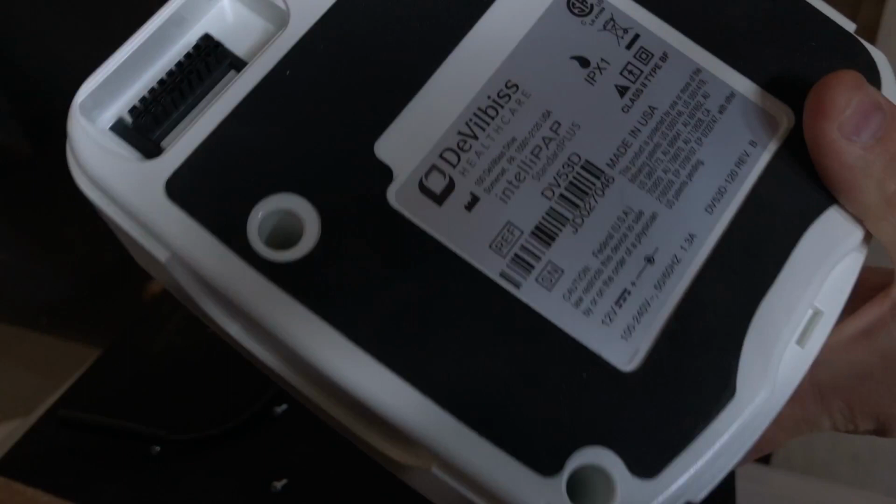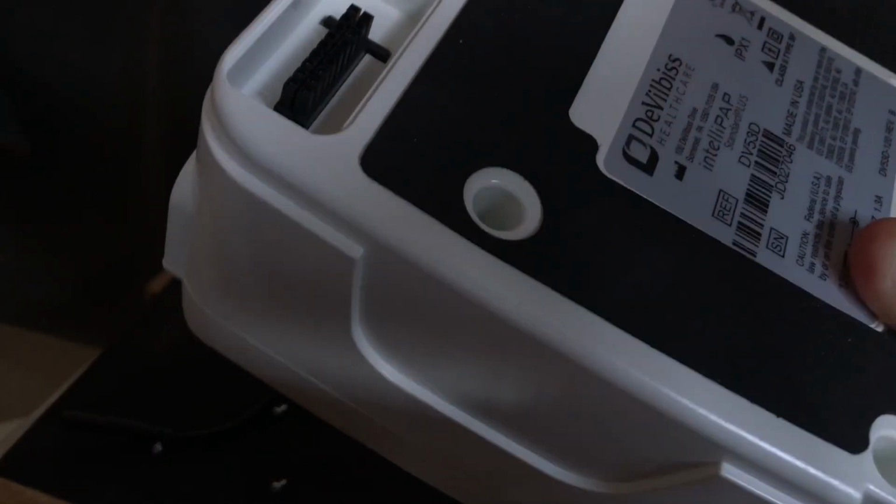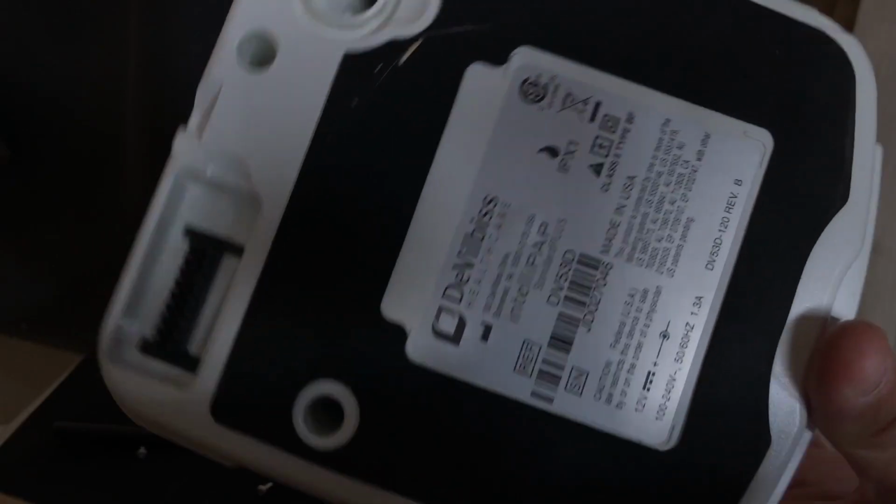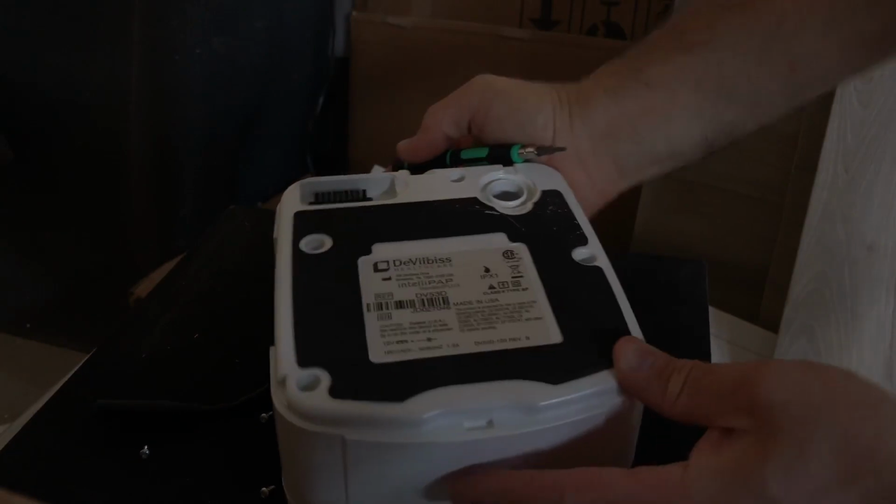Now, there may be some caps in here that are still charged, so we're going to want to discharge them. I'm going to try my best to get in here, but I have a feeling that it's going to be tough to get to those screws. They happen to be some kind of what looks like Torx, but they're really deep inside, you can see. So I may have to cut the video and do a destructive teardown to open this up, because it's going to be tough getting that far down in order to get to those screws. All right, so bear with me. I'll be back in a moment.